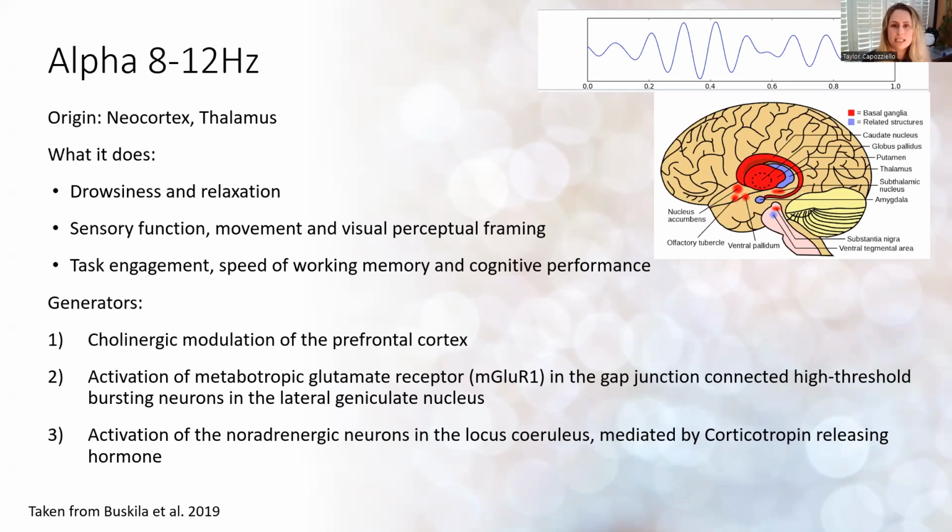And around age 65, it starts to decline, 0.5 hertz a decade. So we're going to see it start slowing down. And it's defined by the morphology being typically rhythmic and sinusoidal, just like we saw in that example of slowed alpha being in the theta band. We have that really sinusoidal rhythm.